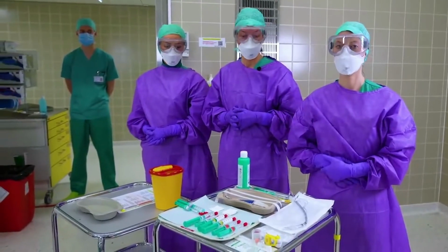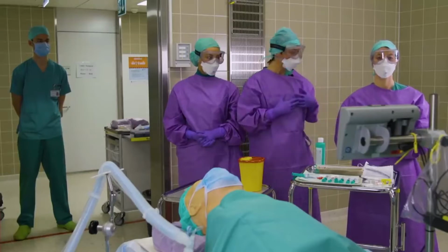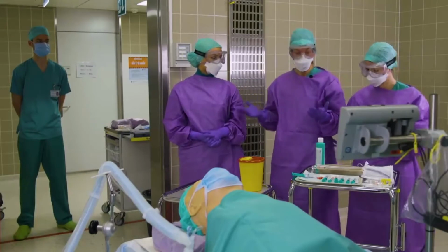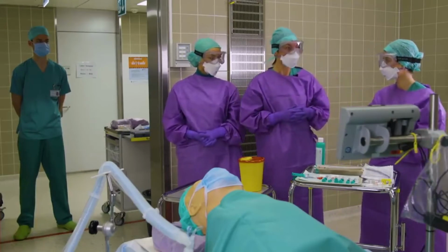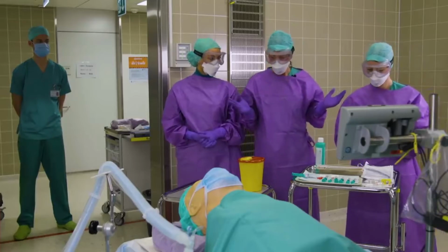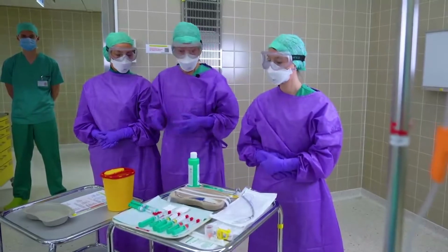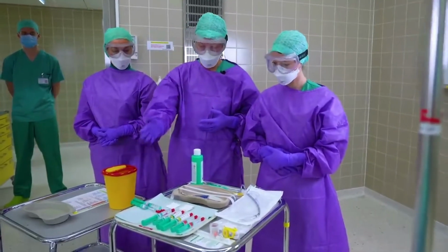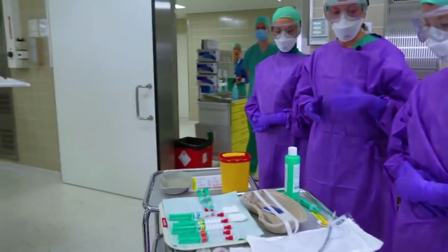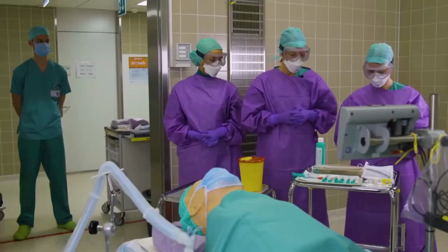First, we have the planning, and as you can see, we are all donned in protective gear, which is according to your local SOPs. We did our body check and we deemed each other appropriate for this procedure. For induction, we have our medications on the tray, as well as our airway materials, including an endotracheal tube with a stylet in place, as well as our video laryngoscope.